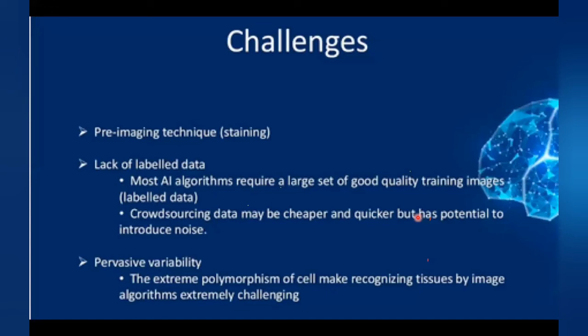There is something called Z-stacking. So this Z-stacking is being used in cytology. It's multi-layering photography of a cell. So the cell is actually shot in 3-dimensional. And these are available with all these scanners which are common. So if the tissue is folded, you can actually feed it through a Z-stack and get an accurate tumor content in that folded tissue. So there's something called Z-stacking. I just want to tell you that.